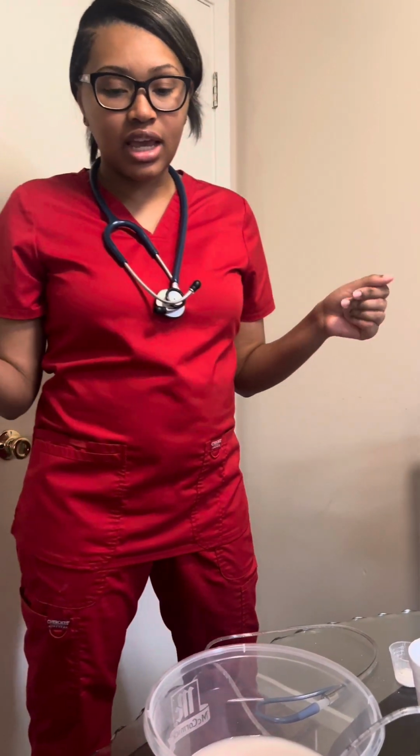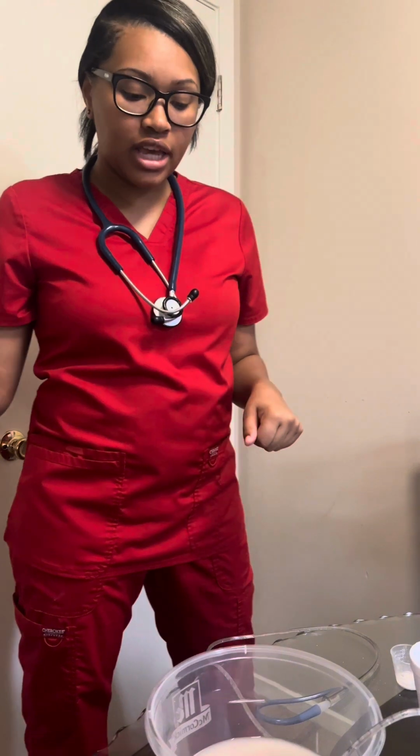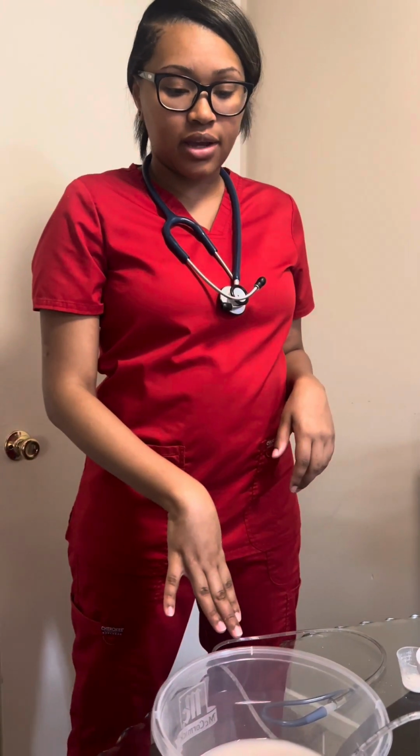I'll be your nurse today. Can I get your name and date of birth? And then I will check the armband. Okay, so today I will be doing medication administration through your tube. Then I would raise the bed to working height, have the patient sit in semi-Fowler's, and then I would let the side rail down.